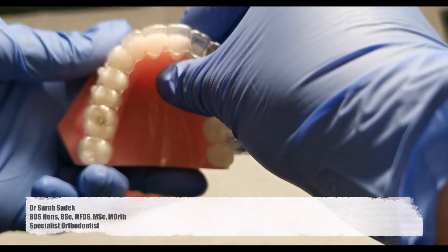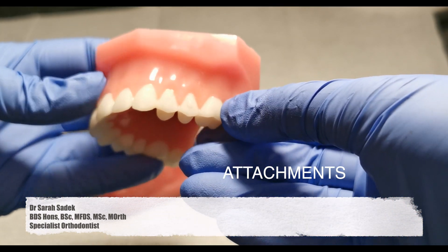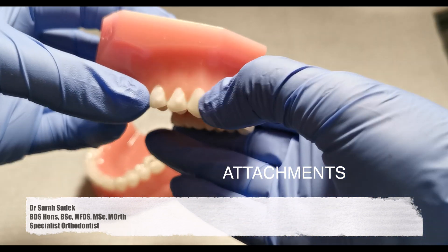There are a few things to bear in mind before you go ahead with your Invisalign treatment. You will have attachments. These are transparent filling-like materials that we stick onto the outer surface of your teeth, and these engage with the aligners so that when you wear them, your tooth movement is improved.